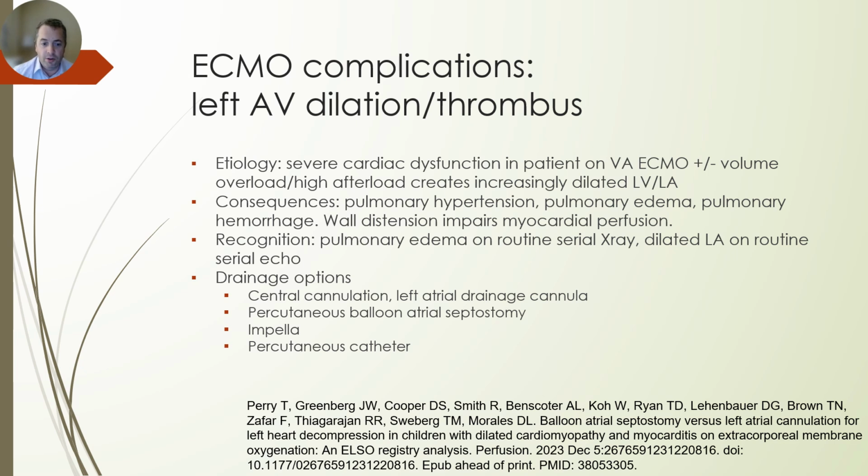There's a percutaneous catheter, you can use an Impella pump. Probably one of the more common ways is a percutaneous balloon atrial septostomy. You can also convert to central cannulation with a left atrial drainage cannula.